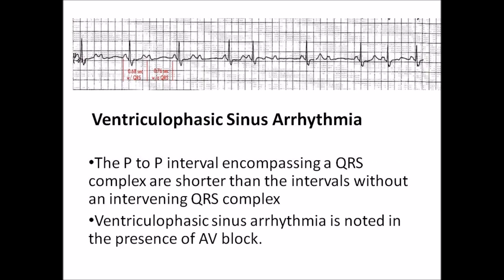For ventriculophasic sinus arrhythmia, the P-to-P interval encompassing a QRS complex is shorter than the intervals without an intervening QRS complex. Ventriculophasic sinus arrhythmia is noted in the presence of an AV block. In this example, upright P waves are seen in lead 2, the atrial rate is about 88 beats per minute, with second degree AV block type 2 (Mobitz 2) manifesting as 2-to-1 and 3-to-2 AV conduction. The P-to-P interval encompassing a QRS is shorter — 0.68 seconds versus 0.76 seconds — compared to that without an intervening QRS.